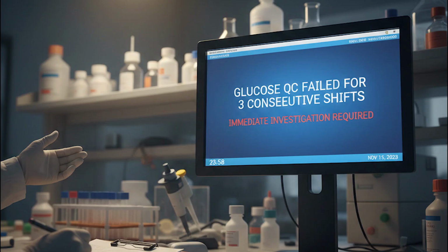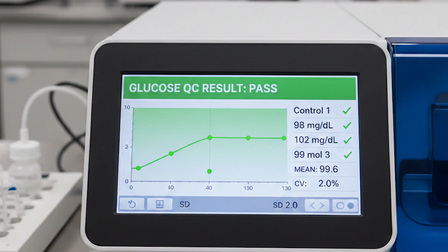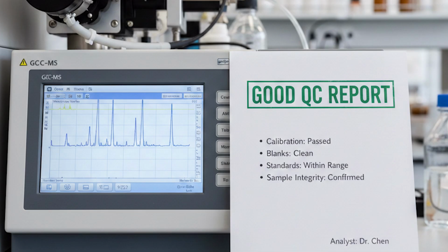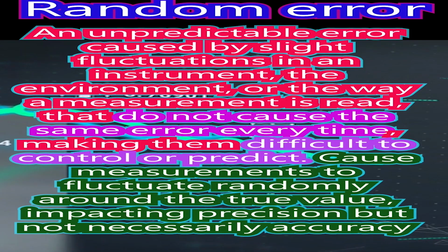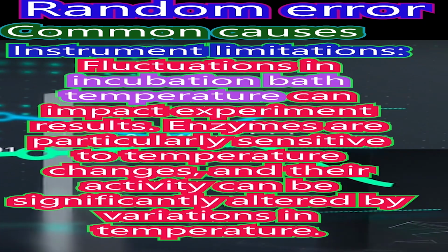Test issue. Check the abnormal test results. Are we getting continuous abnormal results for this particular test, or do you have a doubt? Run the QC, and if the QC results are acceptable, it shows the instrument, the test method and the reagents are okay. If there are issues, fix the reagent, calibration and QC. If all these steps are good, rerun the test and report the results. Rerun can eliminate random errors.